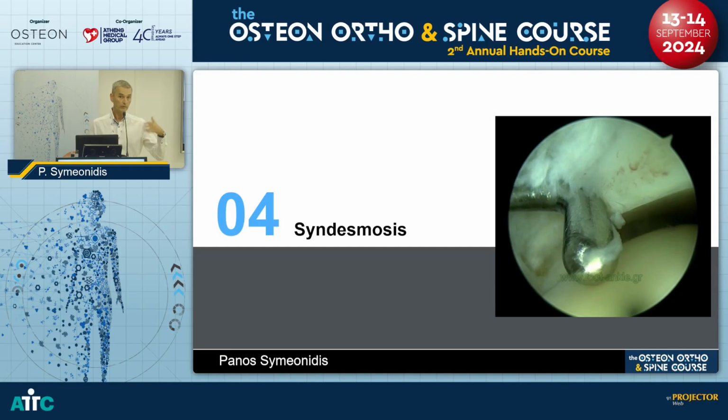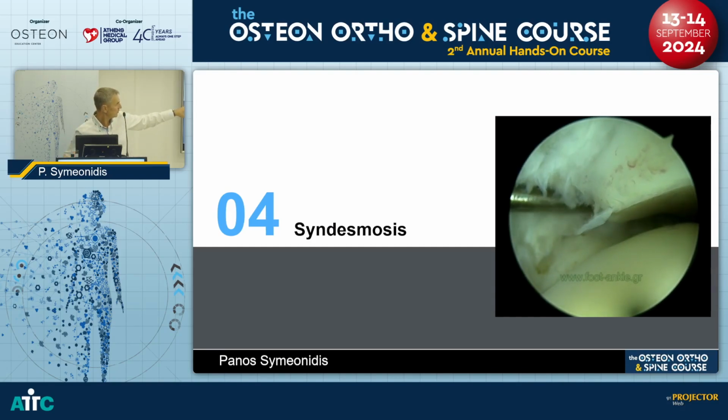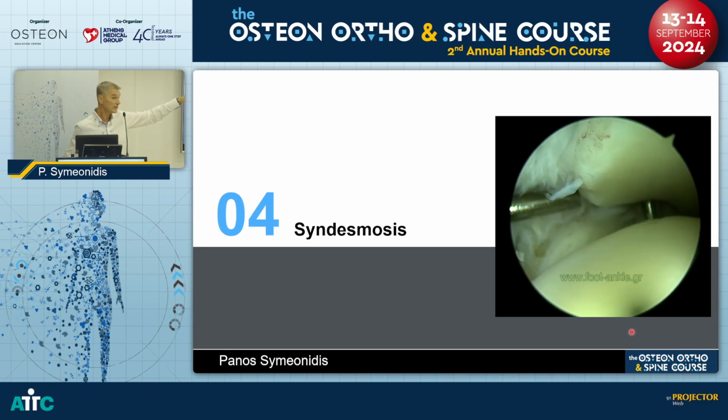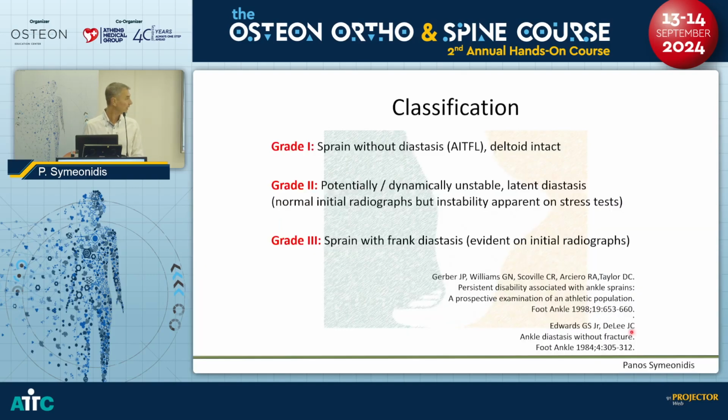And finally, moving on to the syndesmosis. This is how the syndesmosis looks like when it's ruptured. You see this is the tibia, and there is the fibula. And not only can we slide the probe, we can actually twist the probe inside the ruptured syndesmosis. Syndesmosis is a complex, it's not a ligament. Usually we're talking about 2 of the 3 elements of the syndesmosis that have been ruptured.